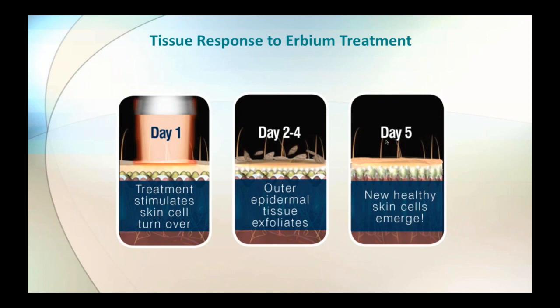So what is this good for in terms of facial aging? This is absolutely great for the patient who has a lot of brown spots, a lot of lentigines, a lot of sun damage, and you want to get some modest skin tightening also. It will not give you as much skin tightening as the CO2, because it doesn't penetrate to the dermis as thoroughly, but it'll do a good job for you. And the key, I've had this done on myself, is it'll reduce your downtime.